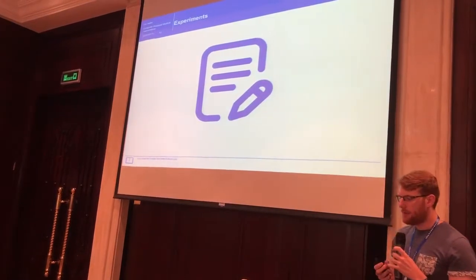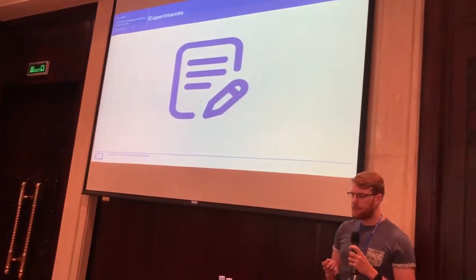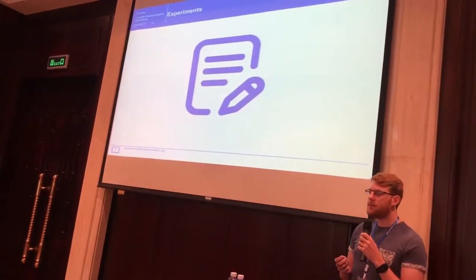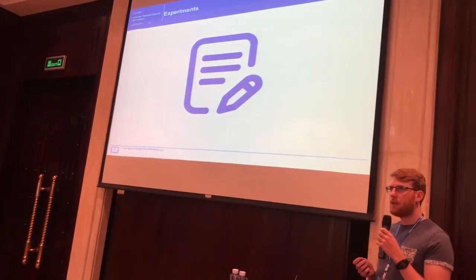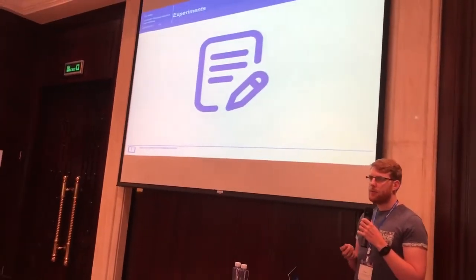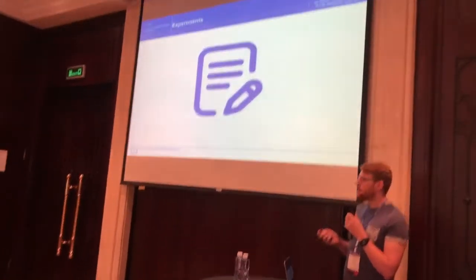And we have some preliminary results on that. So first, we basically did an in silico validation. We have a simulation framework for spectra, where we can produce different spectra belonging to different tissue properties.